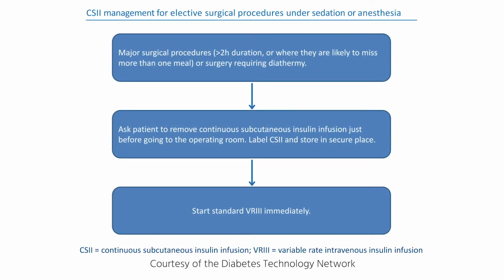But there's other procedures that they may not be awake in, like a knee replacement or a hip replacement, pre-planned for a long time, a lengthy procedure for someone. And obviously one of the keys about allowing them to use their technology is that they are the ones comfortable with it. So what about for individuals with longer procedures? So, I will take this in two ways if you like. Our cutoff, in most of the guidelines generally, is about 2 hours.